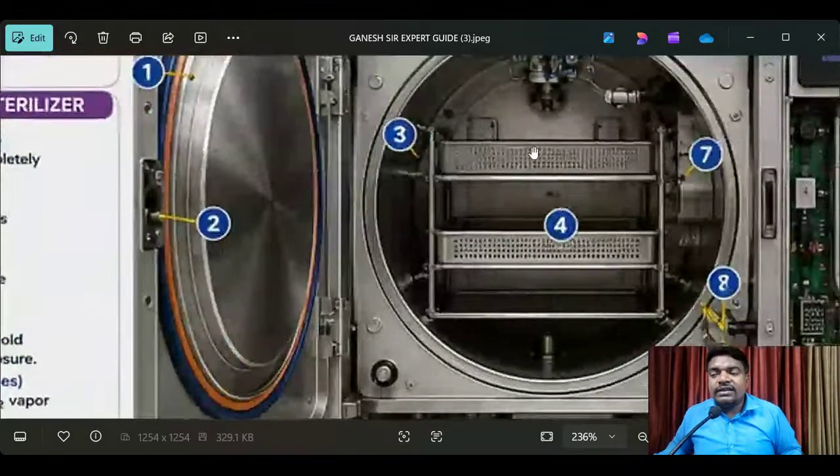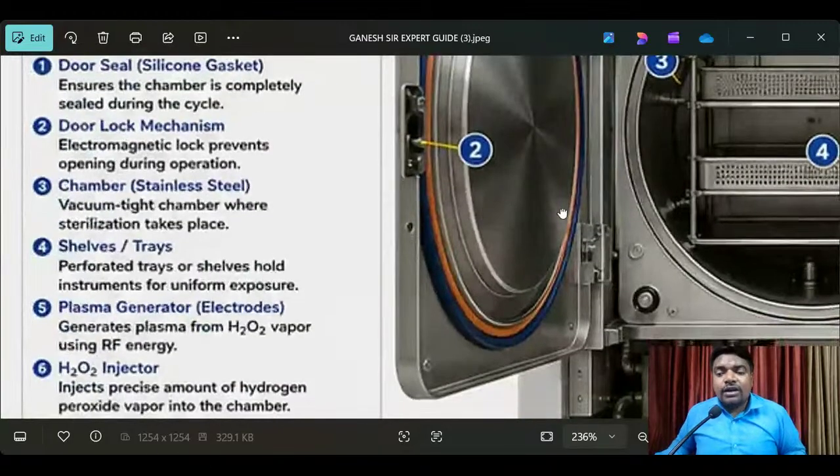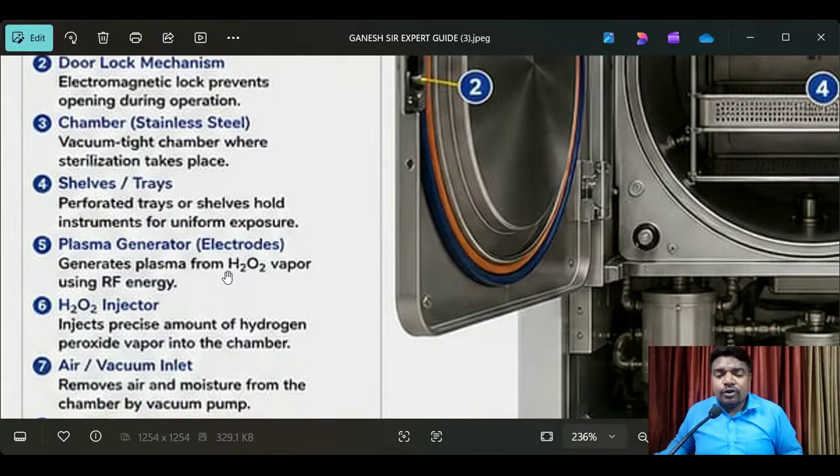Okay, these are all things. What are the things going for sterilization purpose? These are the things we have to keep in proper packaging and proper color codings, everything there. That protocol will be there. We have to follow the instructions given by the technician.